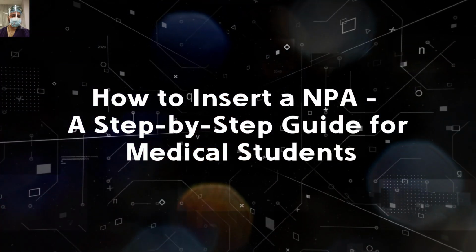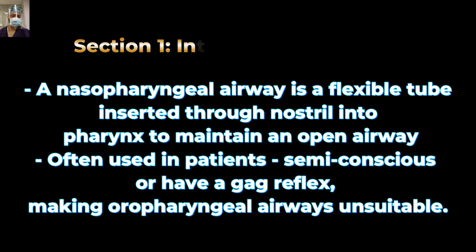So friends, the nasopharyngeal airway is a flexible tube inserted through the nostril into the pharynx to maintain an open airway. It is often used in patients who are semi-conscious or have an active gag reflex.